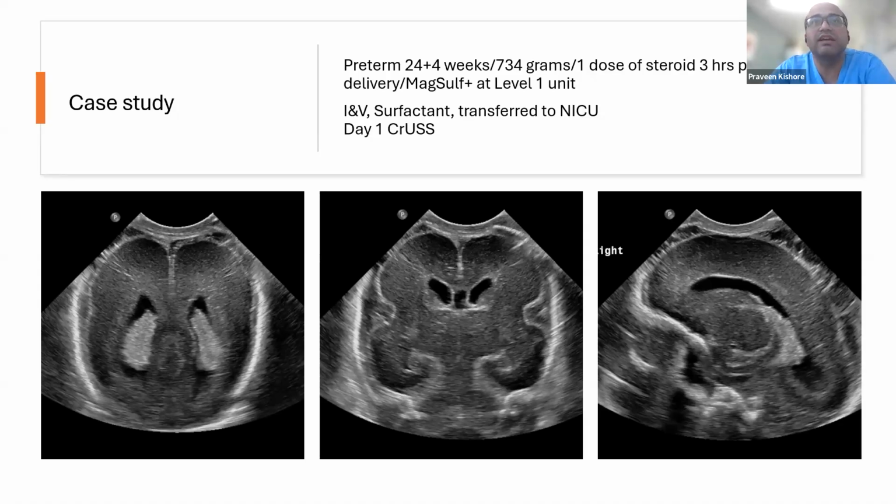So we can't see a clearly large IVH, but the choroid plexus do look quite bulky, and you can see that there is some bilateral ventriculomegaly, which is a bit strange for a day 1 newborn. So we note that and continue to monitor the baby.